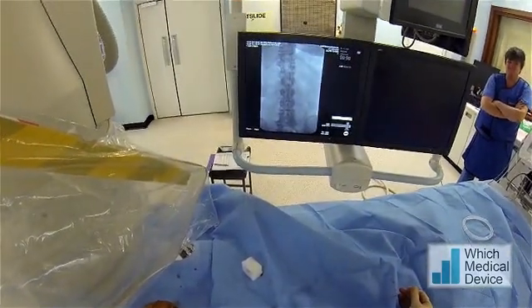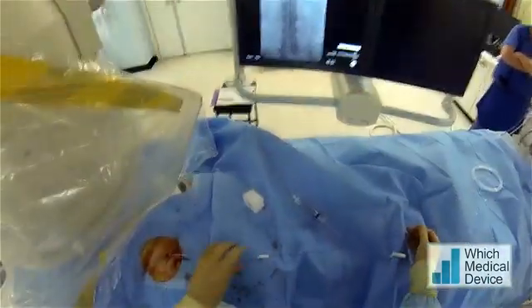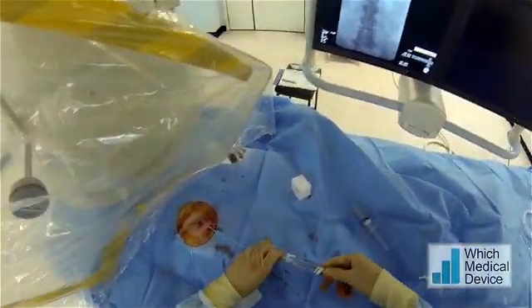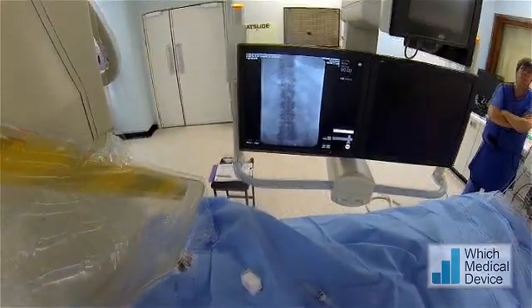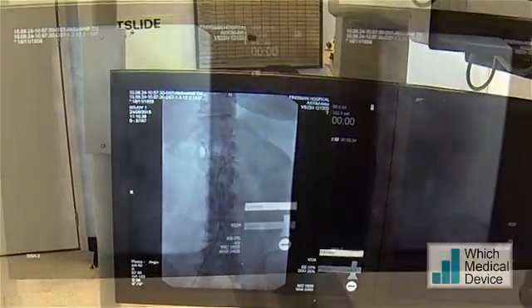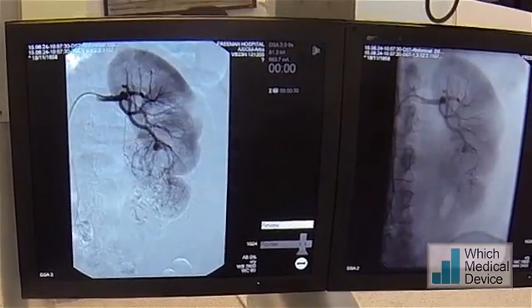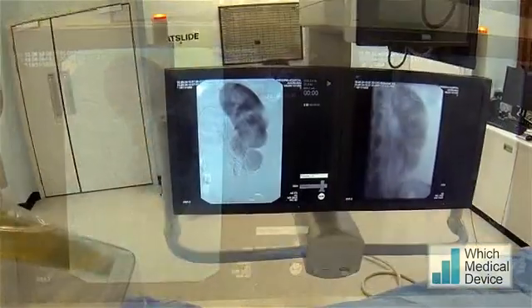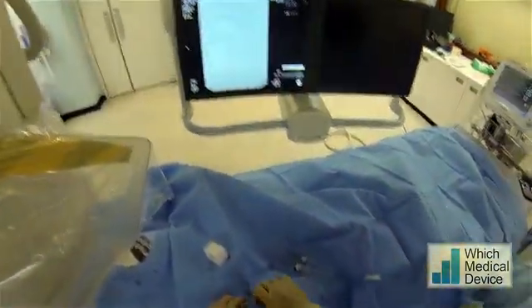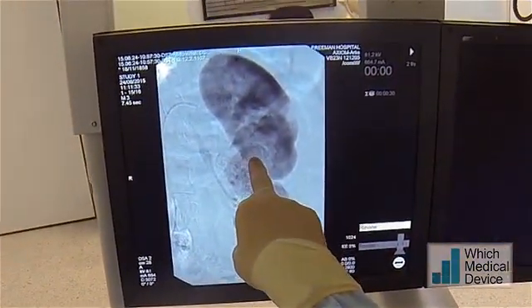Advancing a 5 French Cobra up towards the left renal artery, then we'll do a DSA run in the left renal artery. You can see the AML already. You can see very abnormal blood supply in the lower pole, straight into the AML, and there's an aneurysmal segment just there as well.